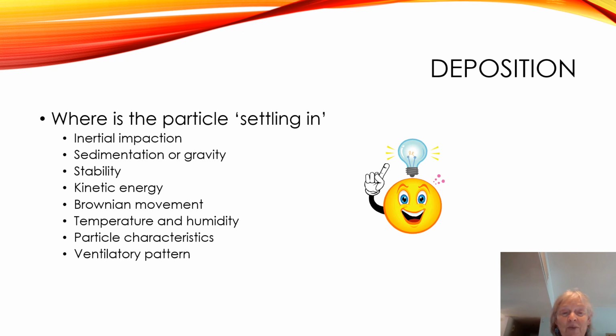Otherwise, you're not going to get the medication you need. Humidity can cause those particles to swell, and as a result of that, now you can't get them out, and now they're too big, and if you do get the particles out, they're going to deposit much higher at that particular point.